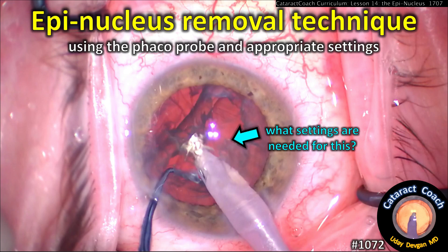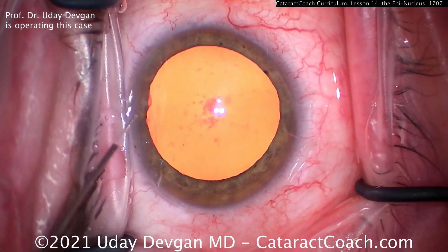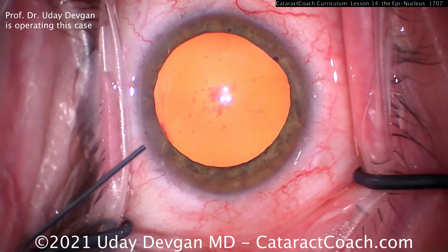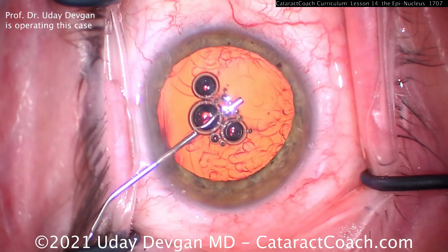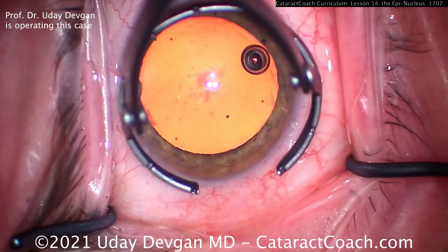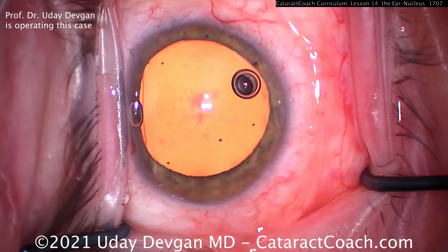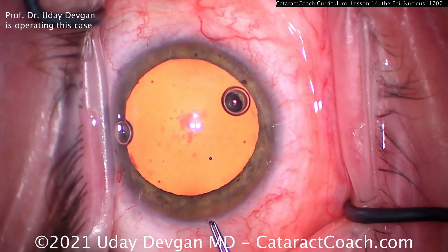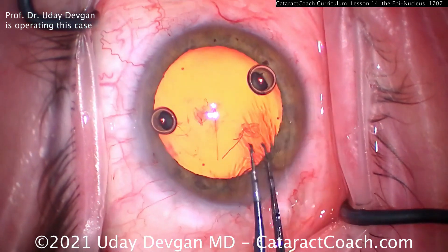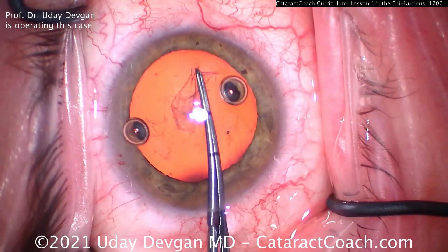CataractCoach.com: epinuclear removal technique using the FACO probe and appropriate settings. This is a complete cataract case — I'm going to show you the whole thing. Here's the beginning of the case: we fill the eye with viscoelastic, then make the main incision using a single-plane technique with good tunnel length — a really nice architecture. Now we're doing a normal capsulorrhexis about five millimeters in diameter; those two marks on the forceps are two and a half and five millimeters from the tip respectively.